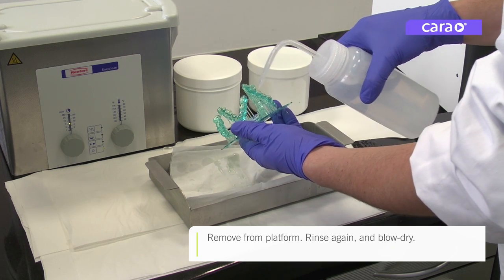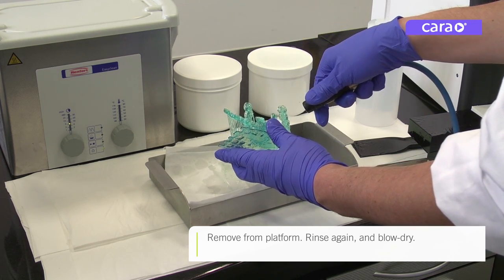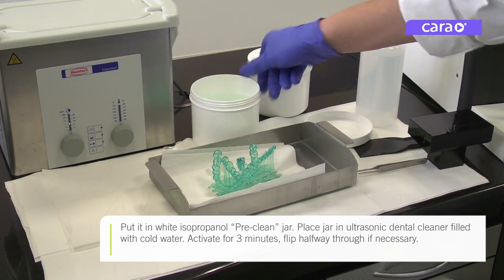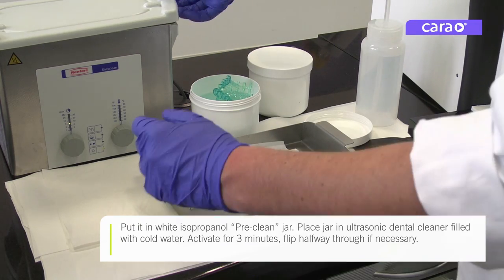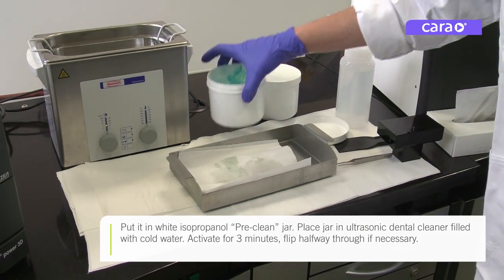Rinse again and blow dry. Put it in the white isopropanol pre-clean jar. Place the jar in an ultrasonic dental cleaner filled with cold water for three minutes, flipping halfway through if not completely submerged.